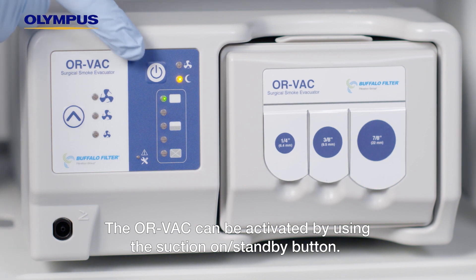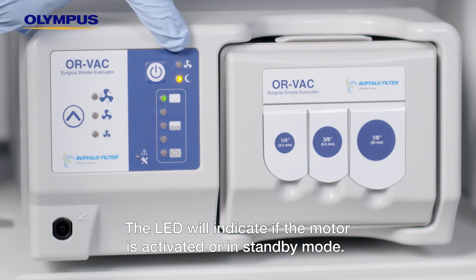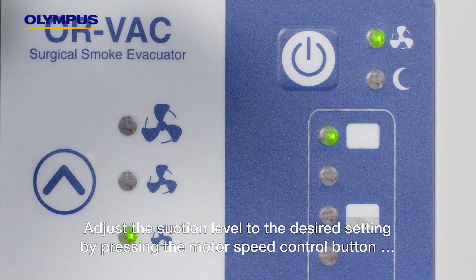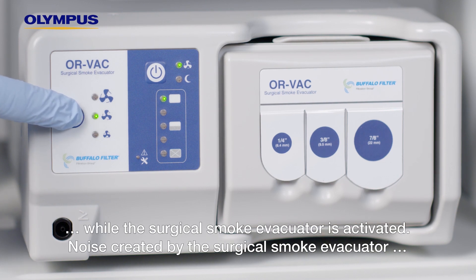The ORVAC can be activated by using the suction on/standby button. The LED will indicate if the motor is activated or in standby mode. Adjust the suction level to the desired setting by pressing the motor speed control button while the surgical smoke evacuator is activated.